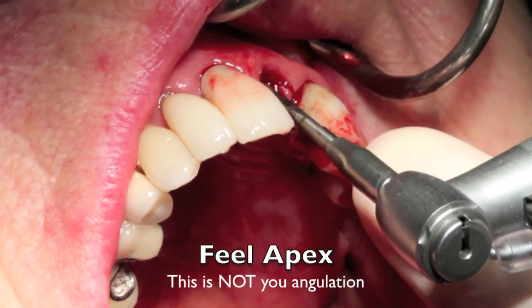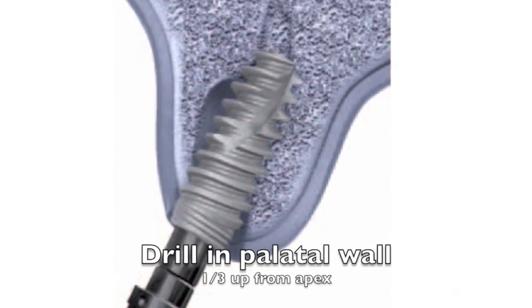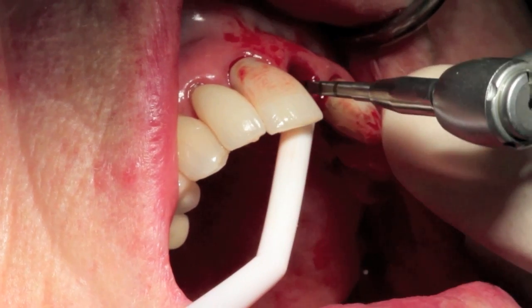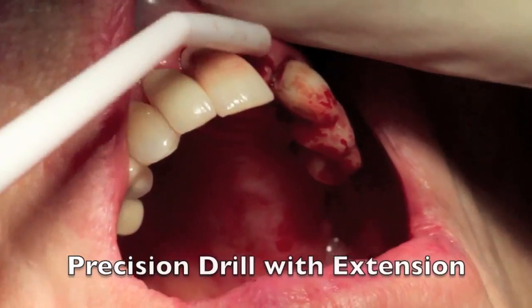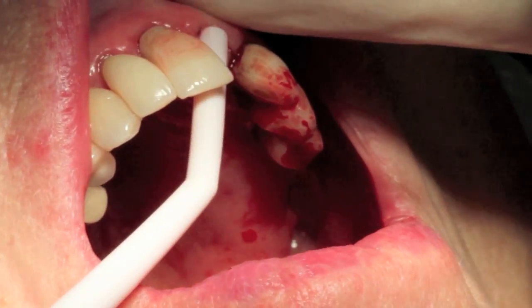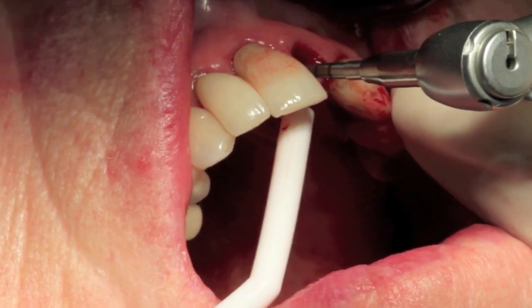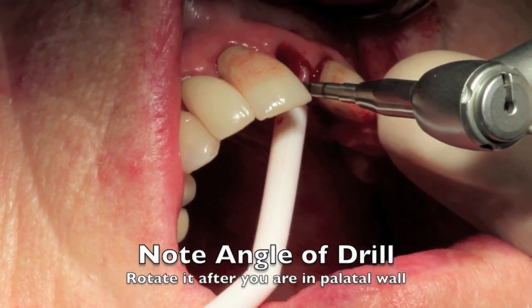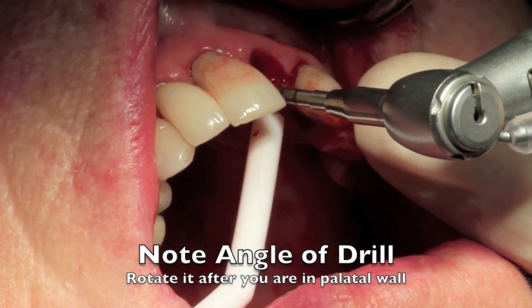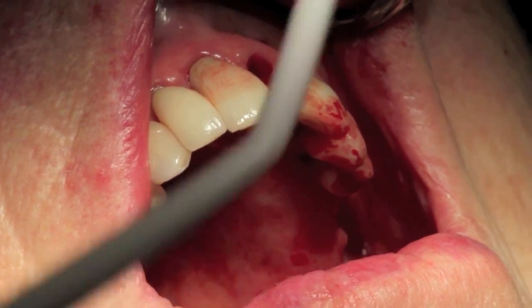The goal is to place the implant in a position not where the tooth was, but actually into the palatal wall or into the lingual area where the bone is very stable. And this allows us to get into a screw retained position for implant placement. So we'd rather be lingual than buccal in this position because of the stability of this bone, and we get too close to the facial plate if you try to put it where the tooth used to be.